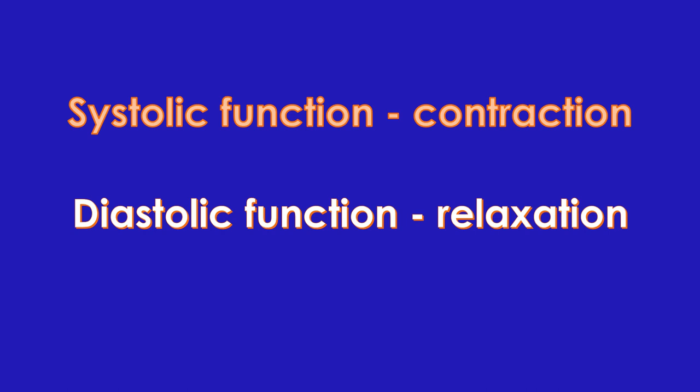A normal left ventricular ejection fraction is usually reported as good left ventricular function. If it is severely impaired, it is noted as severe left ventricular dysfunction. When the left ventricle is stiff and relaxes poorly in diastole, it is reported as left ventricular diastolic dysfunction. Left ventricular diastolic dysfunction is quite common as age advances.